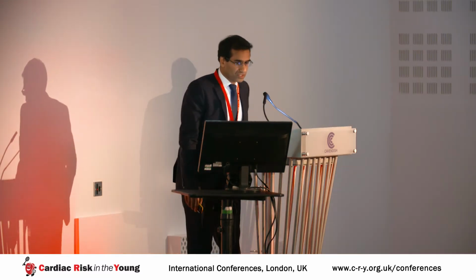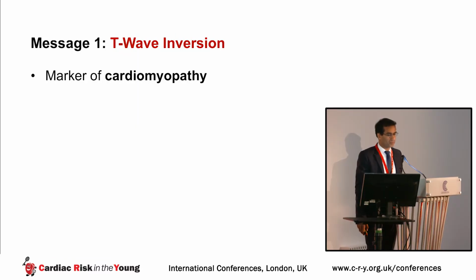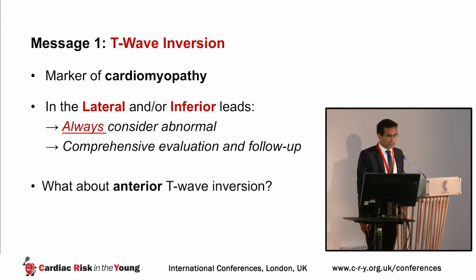So my first message is, with respect to T-wave inversion, that it is a marker of cardiomyopathy. In the lateral and or in the inferior leads, it should always be considered abnormal, and therefore it should prompt you to perform comprehensive evaluation and follow-up, at least an echocardiogram, if not more. So you might ask, what about anterior T-wave inversion? So I'll show you another example.